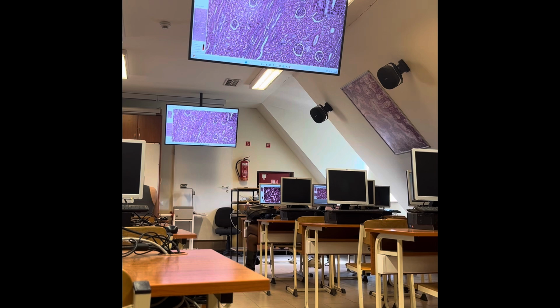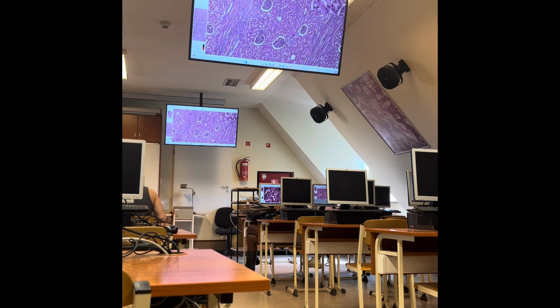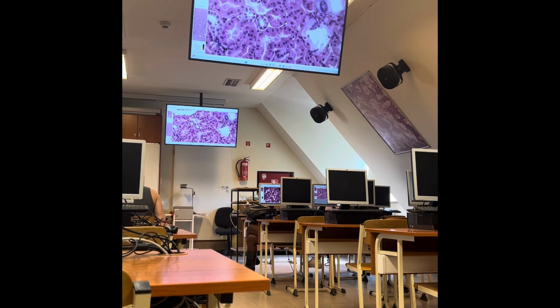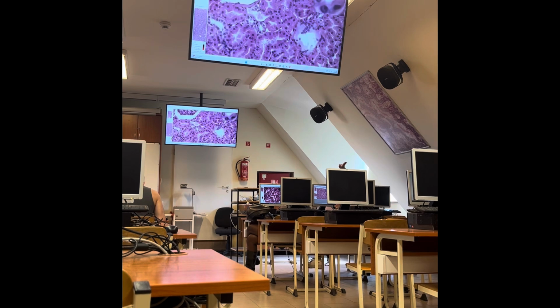And then the distal tubule leaves the medullary ray, enters the cortical labyrinth, and the convoluted segment will be the next. So among the renal corpuscles and the proximal tubules, we can identify the distal tubules, the convoluted segment of these distal tubules you can see.